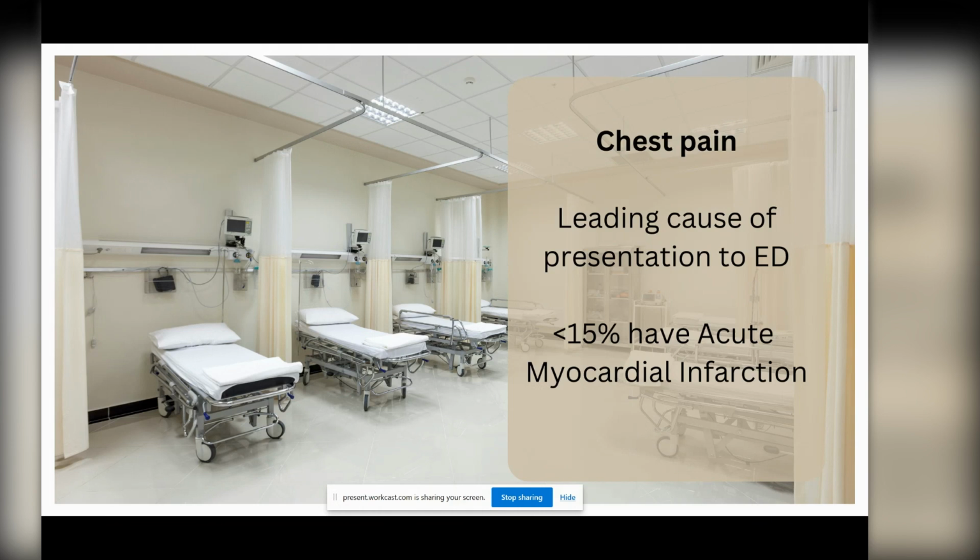These, though, have been very much based upon the lab-based troponin assays, where ideally we have turnaround times for results to be available to us within 60 minutes, but realistically it's often a lot longer than that. That 60-minute time period, though, means the reality is that no matter how quickly you see patients, there's wait times for those results, and second or third need to go back and see patients before you can make final decisions about what is going to happen with that patient.